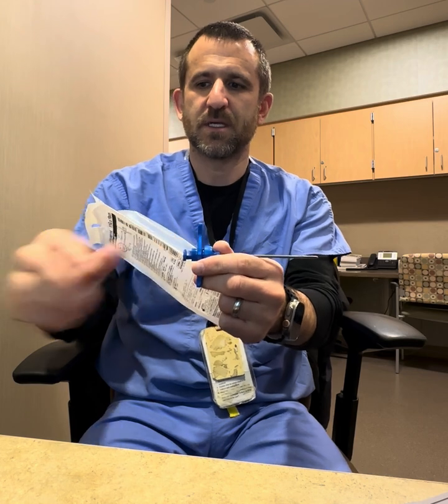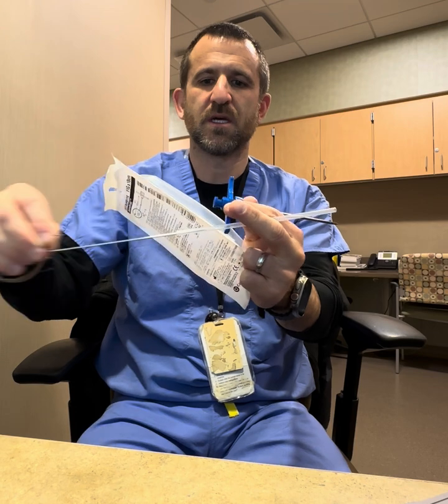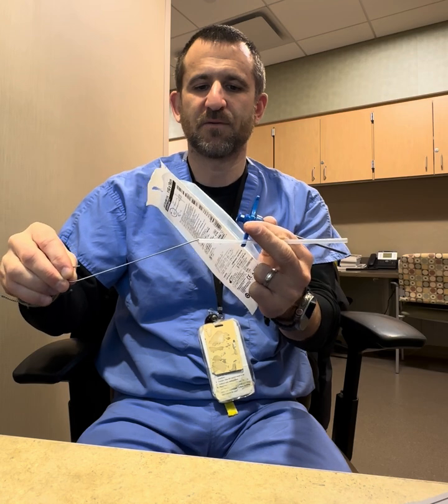Also included is this other device called a shepherd's hook, which is going to help us push the bone sample out of the Jamshidi needle. So pretty simple procedure, very easy to perform.